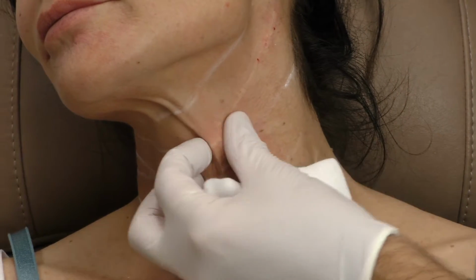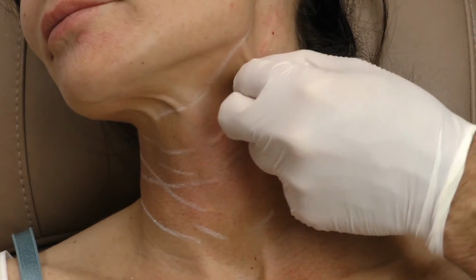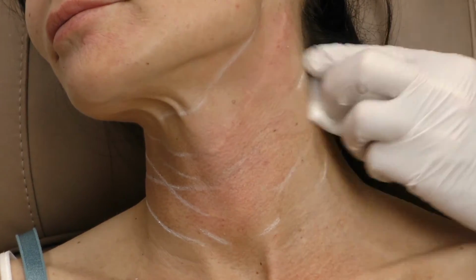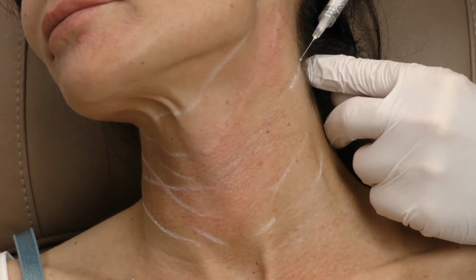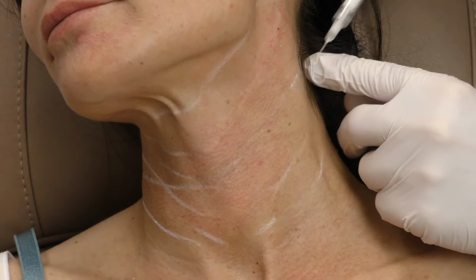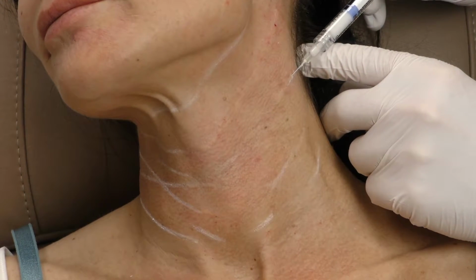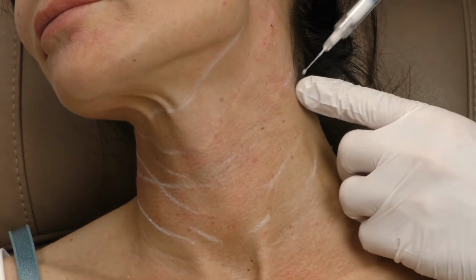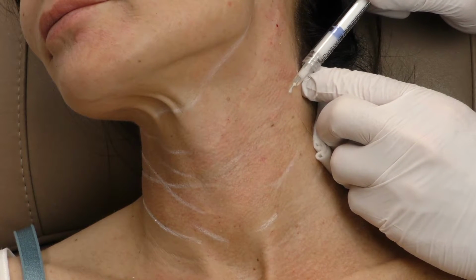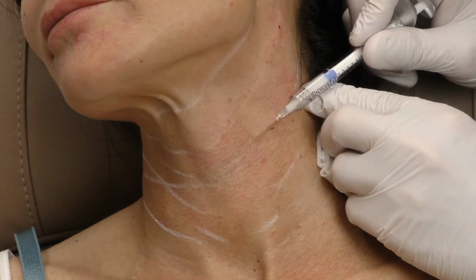So remember, this is a 50-50 dilution, so 50% of what I'm injecting is actually water. And therefore, I'm not too worried when there's a little bit of a bump or a visible deposition, because I know that it's going to be reduced just by resorption of that water, but also because of redistribution. Because the product right now is so liquid with such a low viscosity and such a low elasticity, I know that after injection, it is going to also spread by itself.